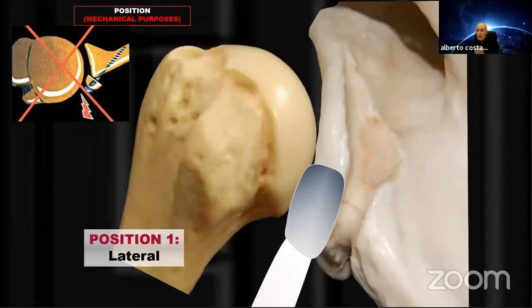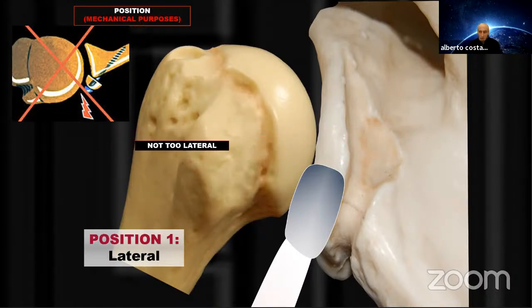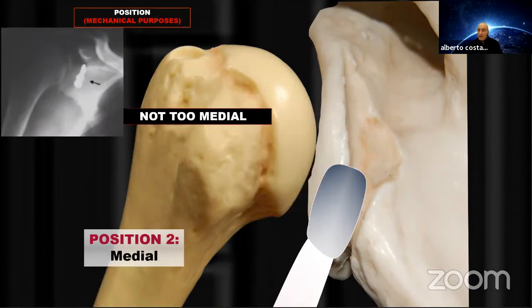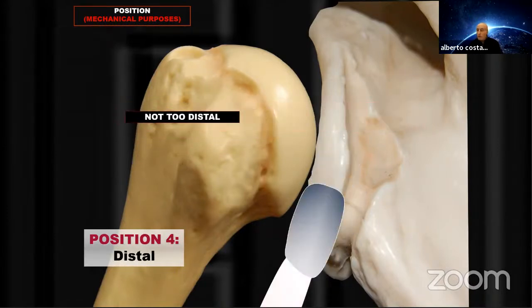So the position is the critical point of the Latarjet, because many of the problems of the Latarjet came from the protrusion of the graft. That means that it is too lateral and can abrade against the humeral head. So we should not be too lateral, but not too medial, otherwise we lose some of the bony effect, not too proximal, but not too distal.